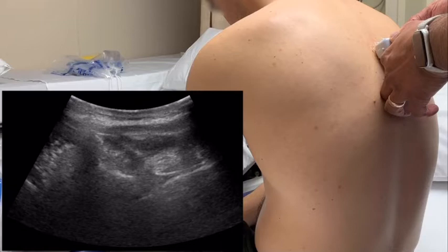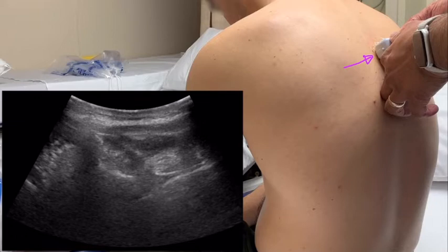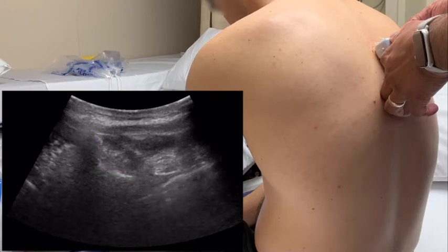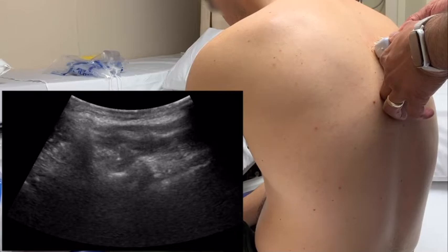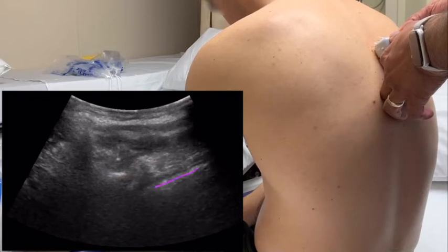I've got Nick here, who's one of my fellows helping me out. He's sitting up and we're doing an ultrasound. This ultrasound is in transverse view to start out with. We're going to be ultrasounding the spine to look for the spinous process. On the left, you can see the tip of the spinous process coming down to the lamina, and as I play the video you can kind of see the definition of the lamina to the transverse process. Incidentally, you can also see the pleura down here below.